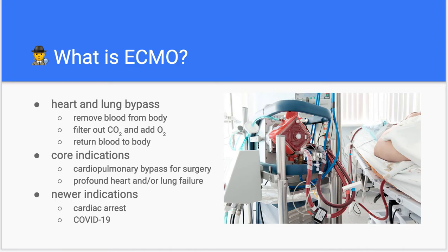It gives you a chance to figure out the H's and T's and focus on what's going on with the patient without necessarily worrying about their lack of oxygenation and their lack of circulation. So that's ECMO in a nutshell.